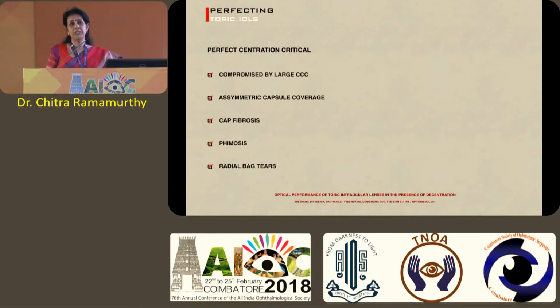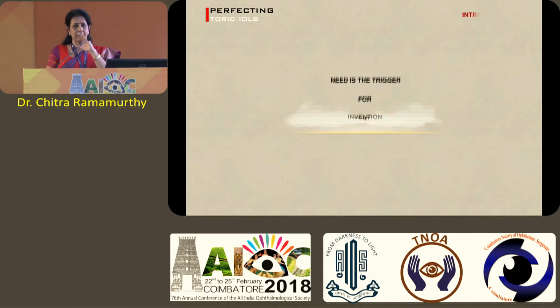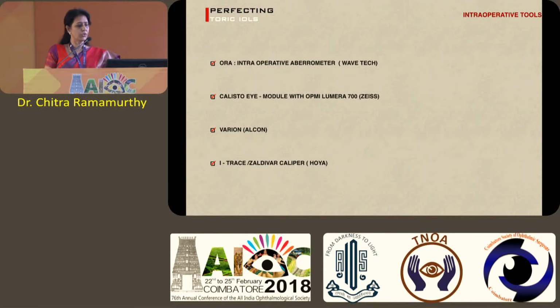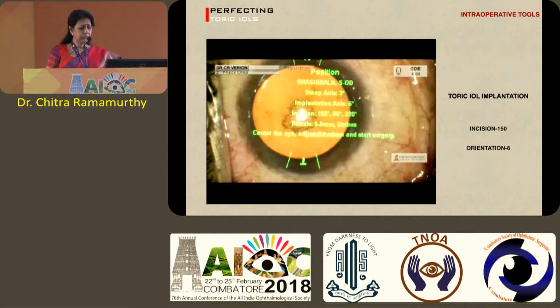Again, the IOL material, AcrySof seems to be very good. If you could get a good centration of your rhexis, it would ensure that there is this ideal wraparound of the rhexis capsular bag over the IOL, which will again ensure that the toric IOL continues to remain in its axis.